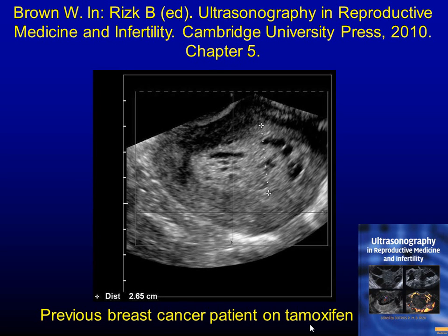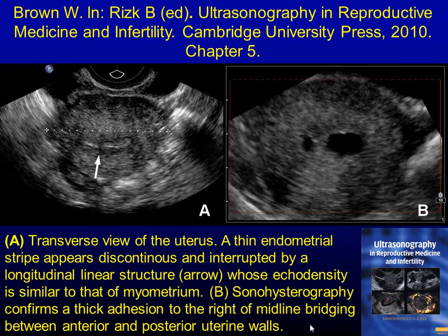So when you put the hysteroscope in the office and you tell her, congratulations, everything looks good, it's okay 90% of the time. But in 10% of the time, the lesion is under the endometrium and will not be picked up by anything, until you get the pathology report saying there is a focus of sarcoma, and I'll come back to that in a minute. So I've covered with you here fibroids and polyps using 2D sono.